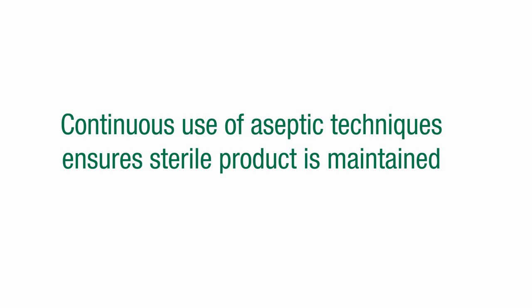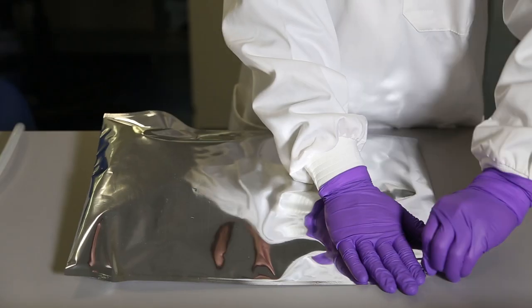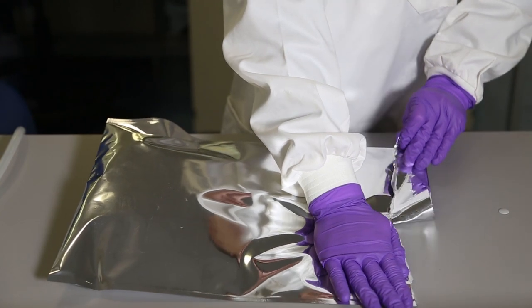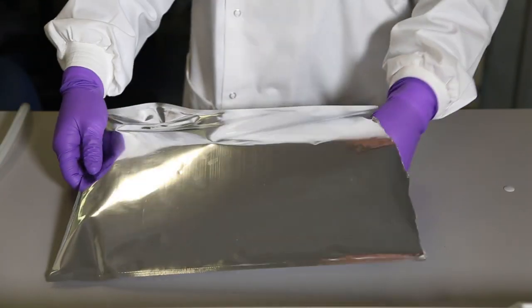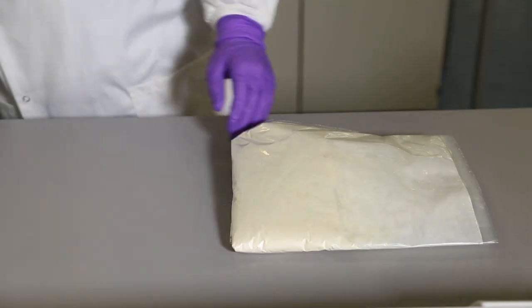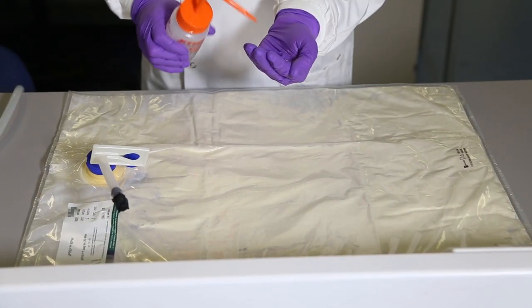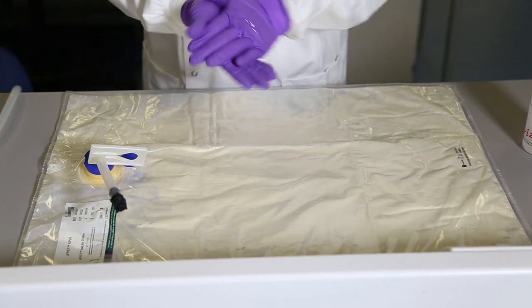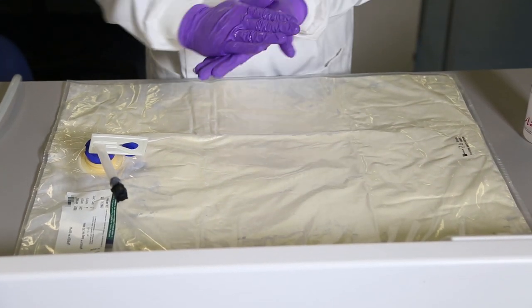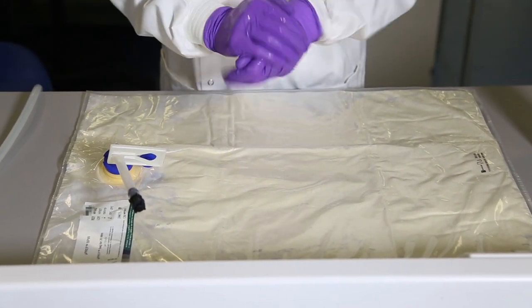The continuous use of aseptic techniques ensures a sterile product is maintained. Pull from one side across to the other to rip open the foil packaging. Pull out the MicroPrep bag and unfold on a clean, flat surface. It is important to note: before handling the connectors on the bag, application of alcohol or any other common laboratory hand sanitizing lotion to your gloves is important.